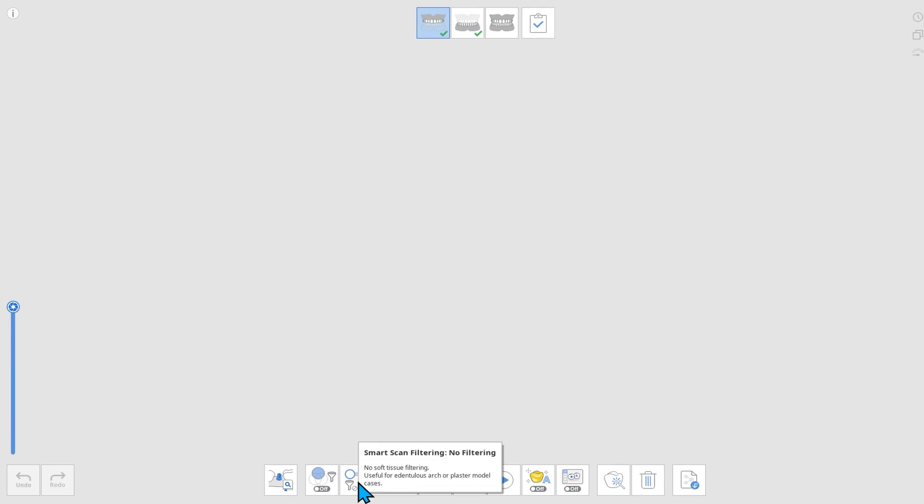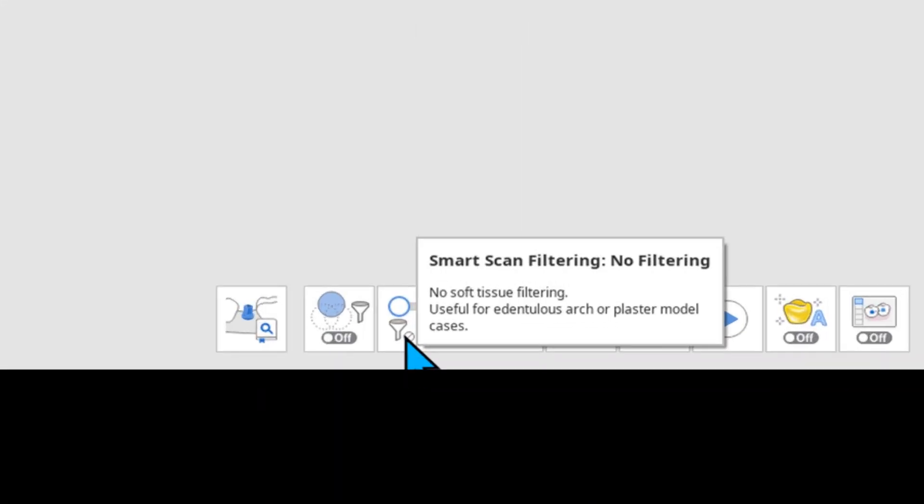In this video, we'll be going over an Edentulus scan strategy. Before we start, please select No Filtering on Smart Scan Filtering. This feature enables the soft tissues to remain intact.